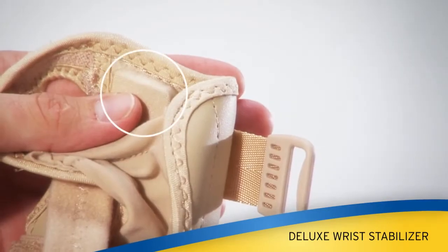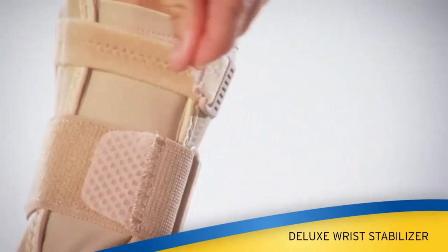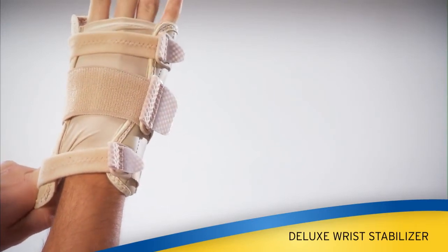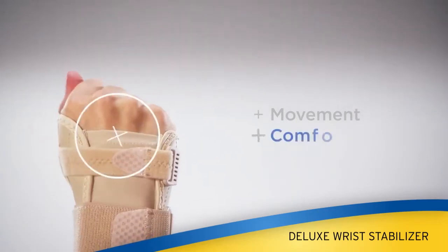Interior gel cushion on palm for great comfort. Adjustable three-strap design allows for extra stability. Easy sleeve design makes it easy to put on and take off. Allows free movement of fingers for all-day comfort.